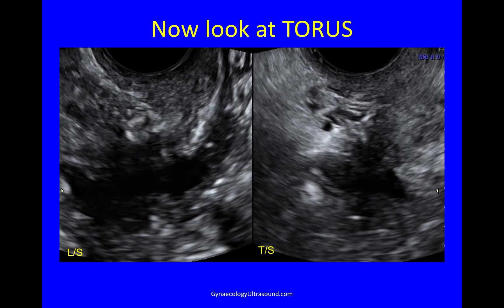Now I'm going to look at the torus. First of all, this is the longitudinal view of the uterus. Here is the cervix. This is where the bladder attaches to the uterus at the internal os, and the torus is at the back in a straight line — this is where the uterosacral ligaments attach to the uterus. You can see that's where this large dark area is that we saw immediately before. To look at the torus, I'm now going to rotate my probe 90 degrees anticlockwise, and I can see that the abnormality behind the torus is mainly on the right-hand side of the pelvis.